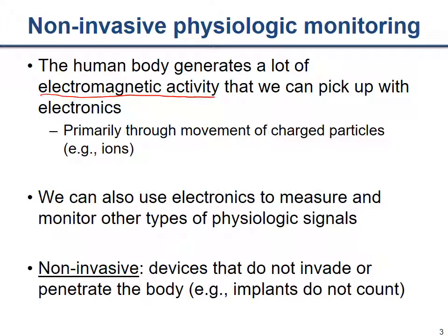And in particular, we're going to place a certain amount of emphasis in this course on non-invasive means. And what we mean by non-invasive are devices that do not invade or penetrate the body. Okay, so not implantable devices, but things like wearable devices we're going to focus on a lot. We'll also talk about implants, of course, but for the purposes of the next several lectures, we're going to focus mostly on non-invasive types of measurements.